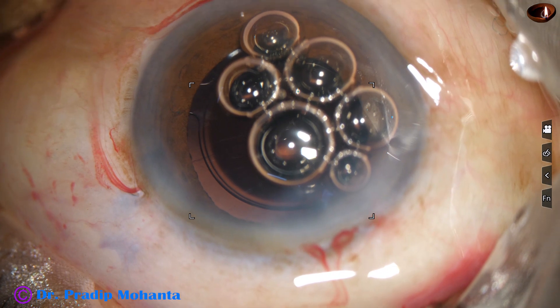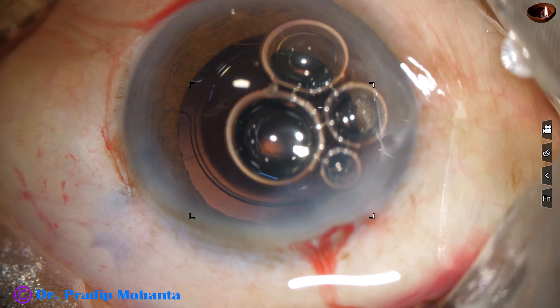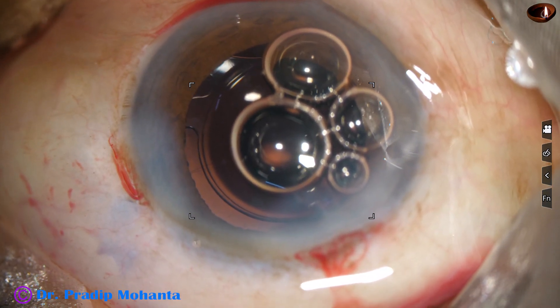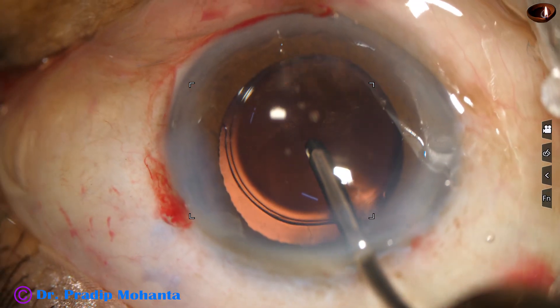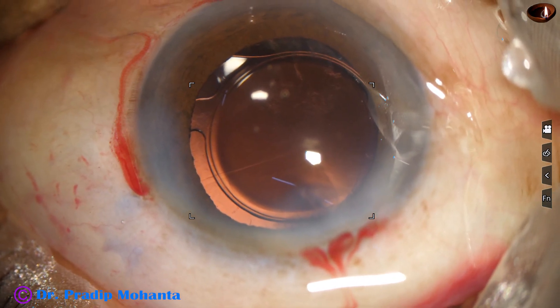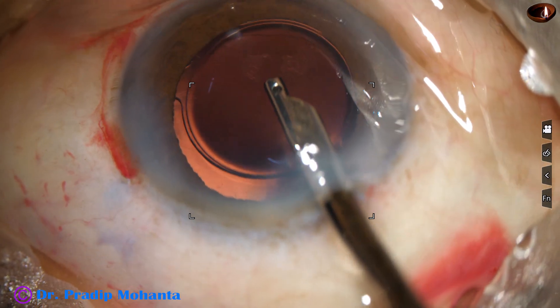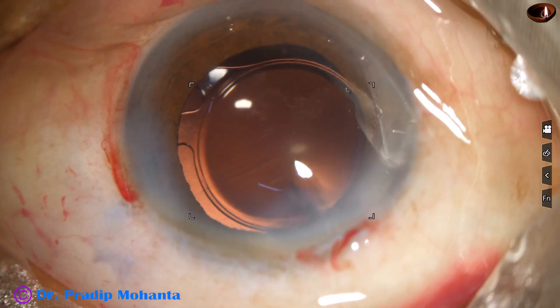A bit of moxifloxacin is instilled, and now is the time to close the wound and side port. The corneal stroma on either side of the side port is hydrated so that this stab incision gets closed. Using an irrigating cannula to remove air bubbles, I find some cortex at 6 o'clock. Some cells are sticking to the posterior capsule near 6 o'clock, but I don't want to remove that because one haptic had come out — I don't want to prolapse the haptic again. I remove the cortex and leave the cells near 6 o'clock sticking to the posterior capsule. The anterior chamber is formed nicely and the case is concluded.